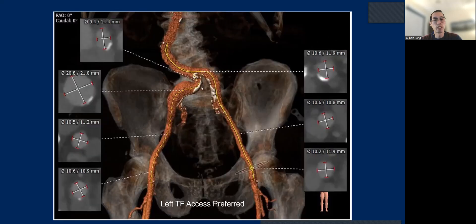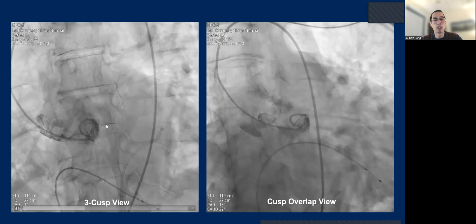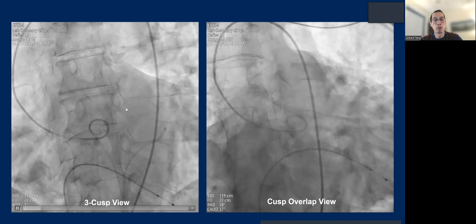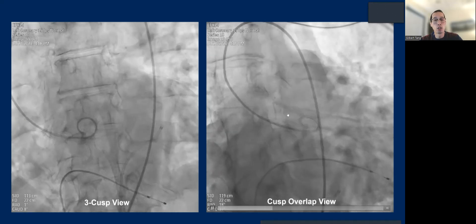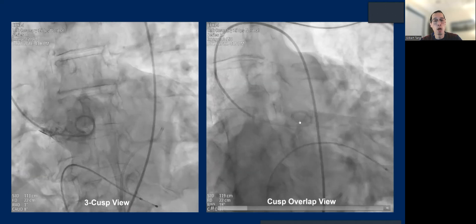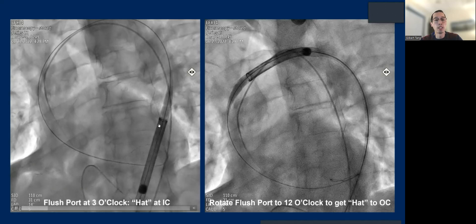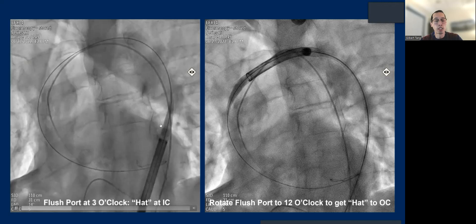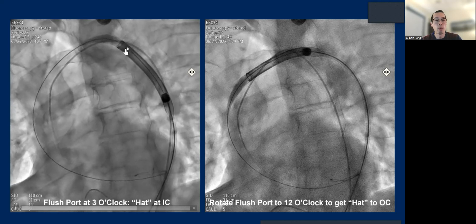This patient has a tortuous right iliac axis, so we decided to go from the left. We did pre-balloon with a 23-millimeter True balloon despite previous BAV, to better condition the valve and avoid post-dilatation. We deployed at 3 o'clock in a cusp-overlap view. The common theme: pigtail on the right cusp, get the three-cusp view, swing over to get the cusp-overlap view. Alternatively, you can place a J-wire into the left cusp and superimpose the J-wire and pigtail to generate the cusp-overlap view. One of our earliest cases — the hat marker was in the inner curve rather than the outer curve as it crossed the arch.